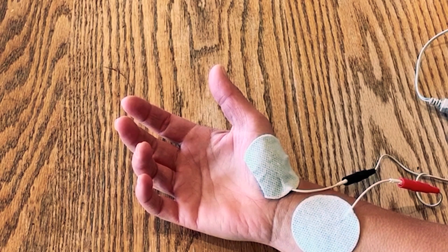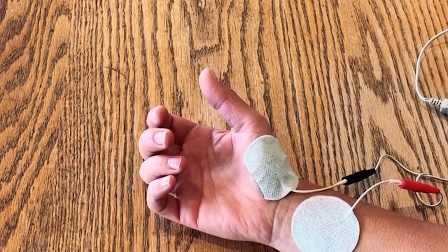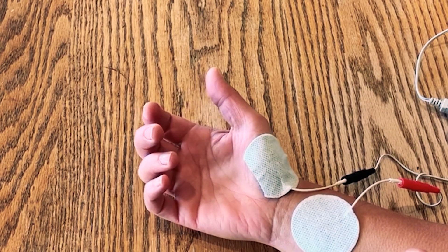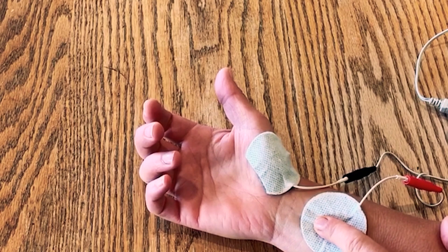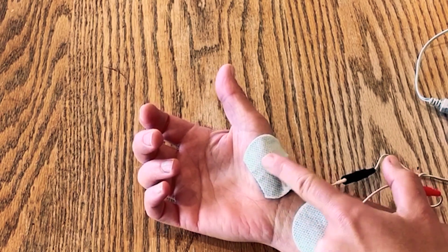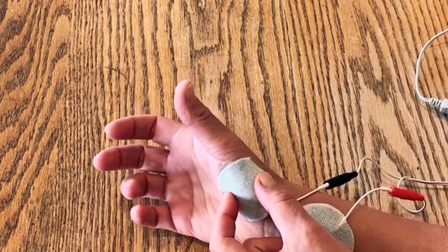Electrode placement for grasp — that will be finger flexion and thumb adduction and flexion to meet the fingers. So one electrode on the finger flexors, just near the wrist crease, and then one electrode over the thenar eminence of the thumb — the fleshy bit at the base of the thumb.